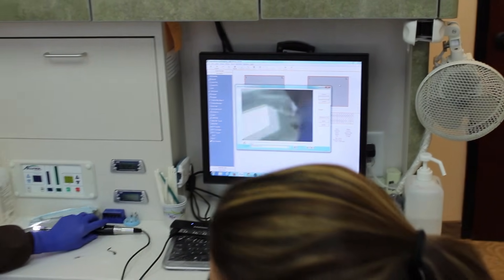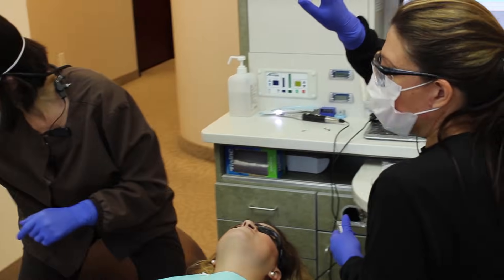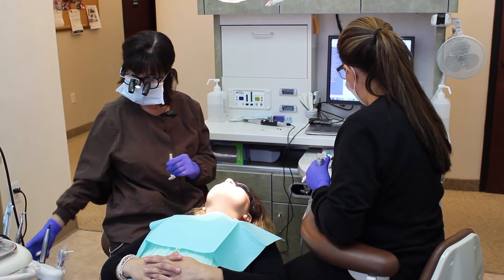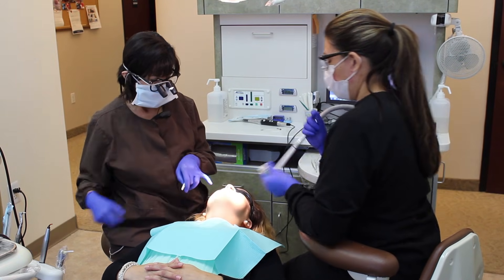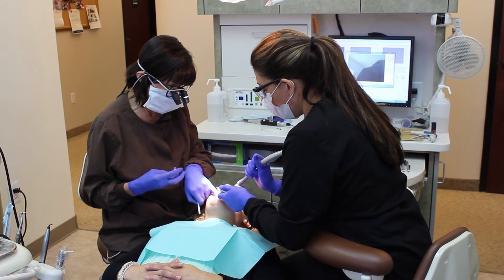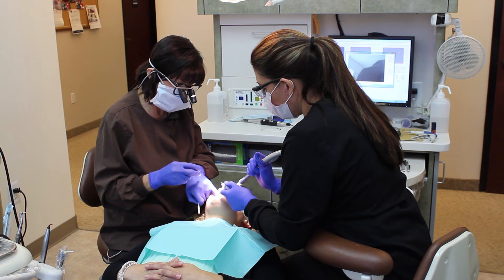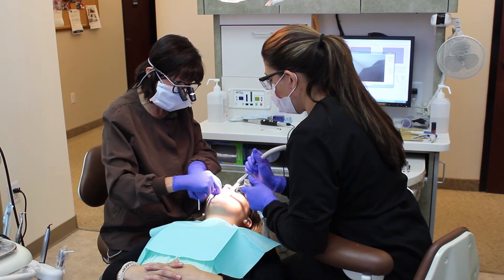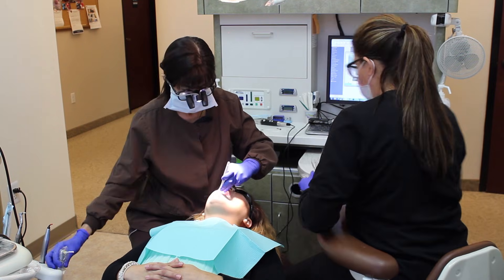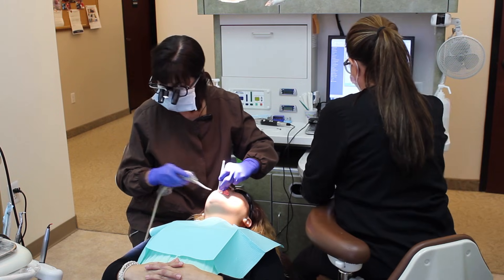That's the picture with the cavity taken out. Let's go ahead and get this filled. We were able to remove the cavity without giving her a shot, without drilling into her tooth. She's not numb at all and she hasn't had any pain.